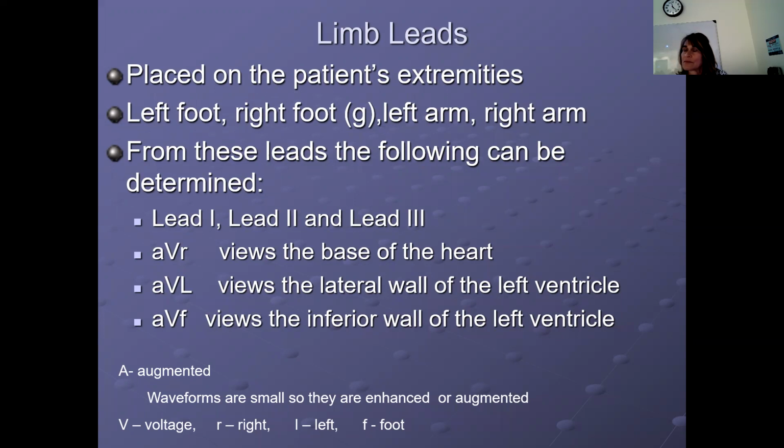I see people from all over the place, and the EKG does look different if you don't put it right. But if somebody walks in with chest pain, we'll do a rapid EKG, and they'll be sitting in a chair, which is not ideal. I'll just put the bottom leads at the corners, like at their hips.